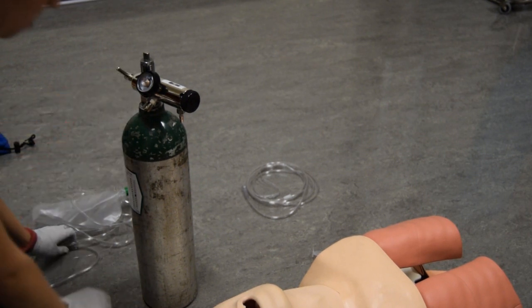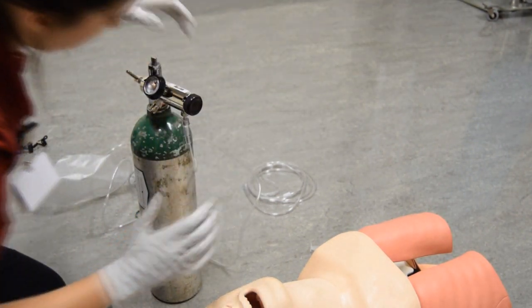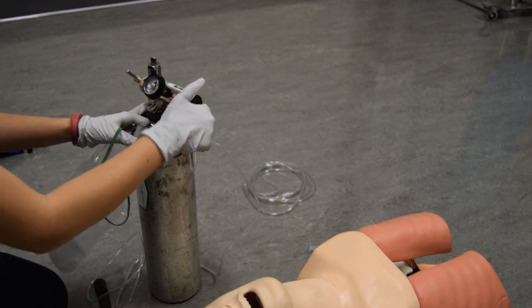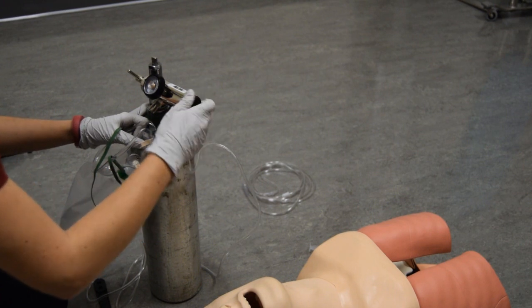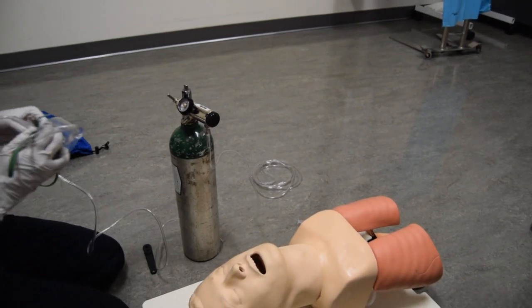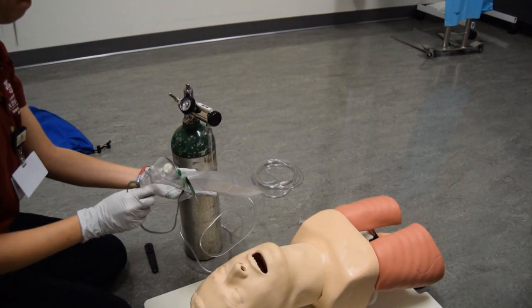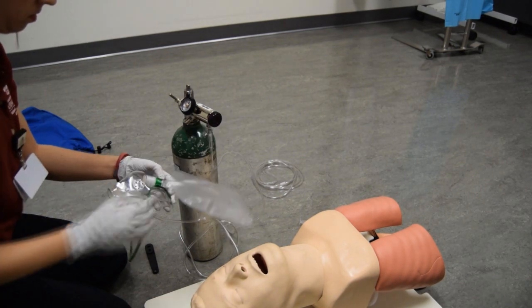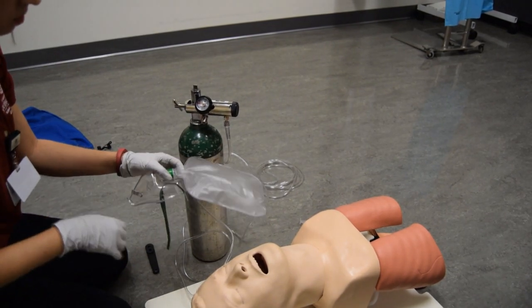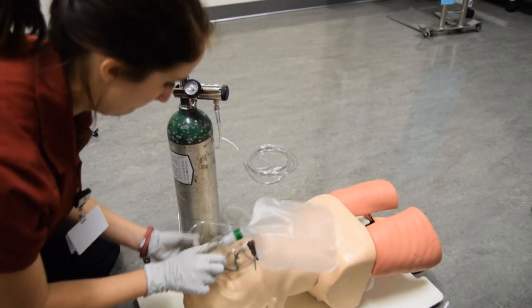Attaches non-rebreather mask to correct port of regulator. Turns on oxygen flow to pre-fill reservoir bag. Adjusts regulator to assure oxygen flow rate of at least 10 liters per minute. Attaches mask to patient's face and adjusts to fit snugly.